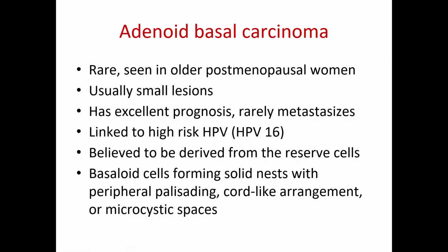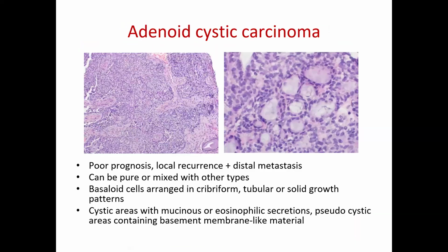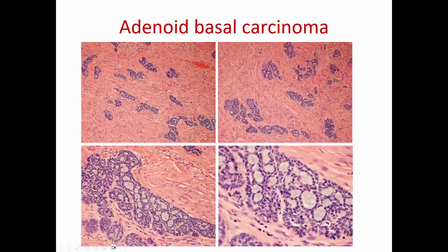It is adenoid basal. The significance of this is that you make sure that your gynecologist knows that you are not calling it adenoid cystic. You are not calling it that, because that is a bad actor, but this is a very low malignant potential tumor.